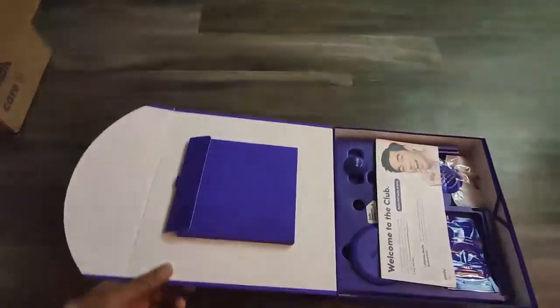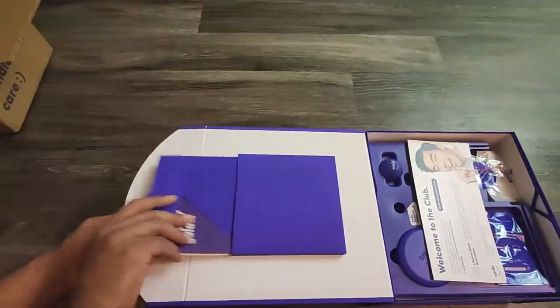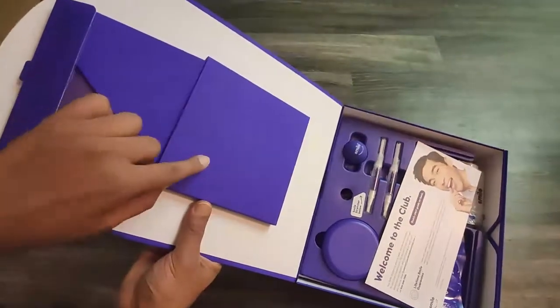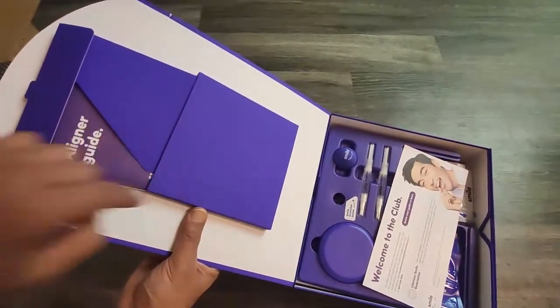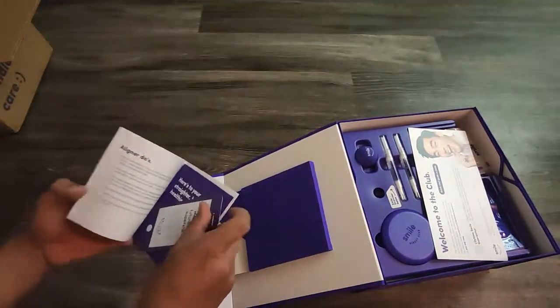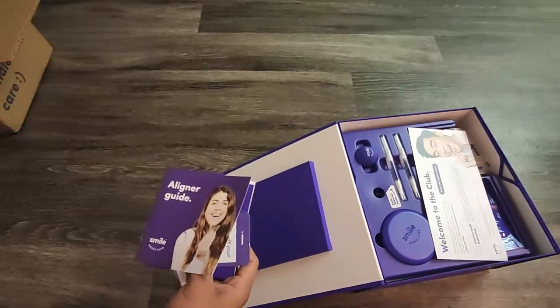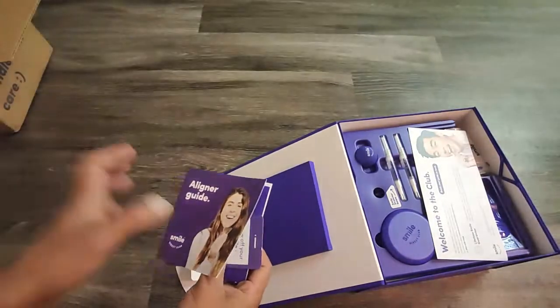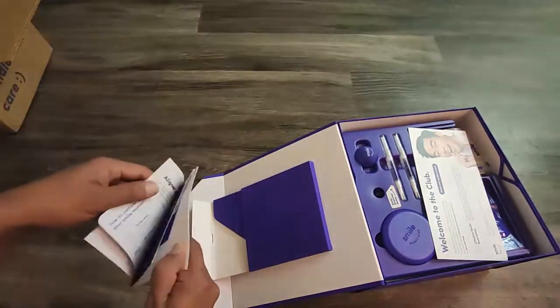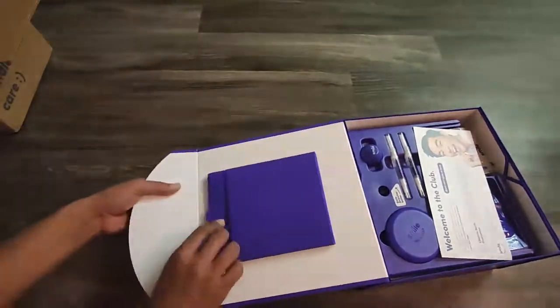Inside the box there is an envelope and a few other items apart from the invisible aligners. The envelope contains user guides, aligner guides, some flyers, and discount coupon codes. It also has 'SmileDirectClub' written on it. Inside you can see aligner do's and don'ts, more flyers, discount codes, and additional information booklets.